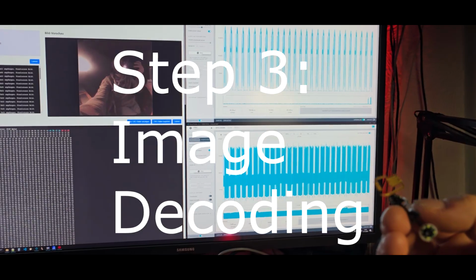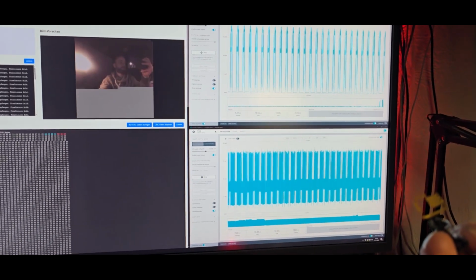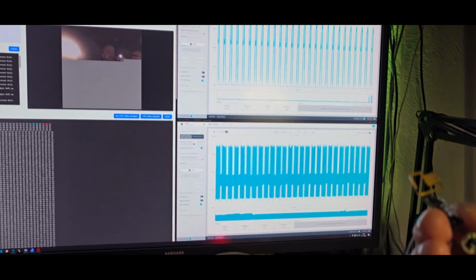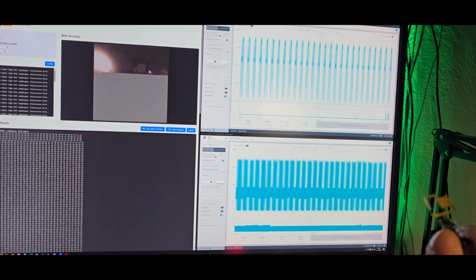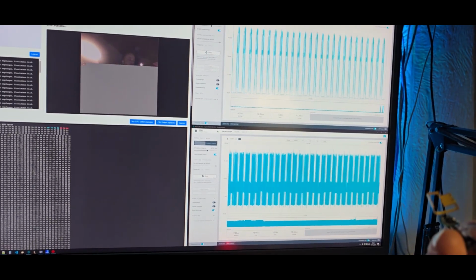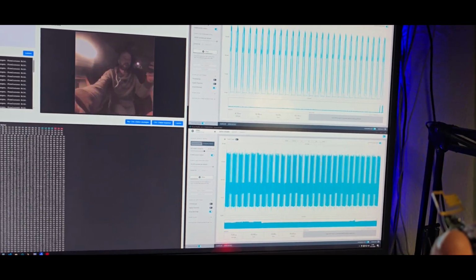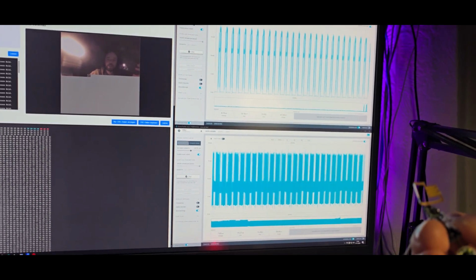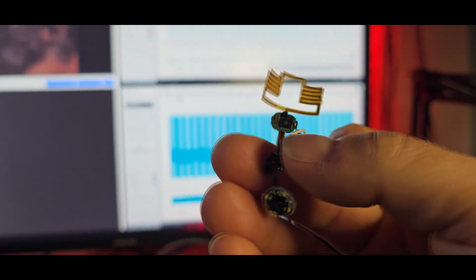Well, well, well, would you look at that? After now way too much time trying to figure out what the image encoding mechanism is, it turns out it is just simply JPEG, just without the header. And as Larry mentioned, it's most likely meant to be MJPEG then, so a video format. And as you can see, we can fully receive the image from the camera via RF and the CC1310.